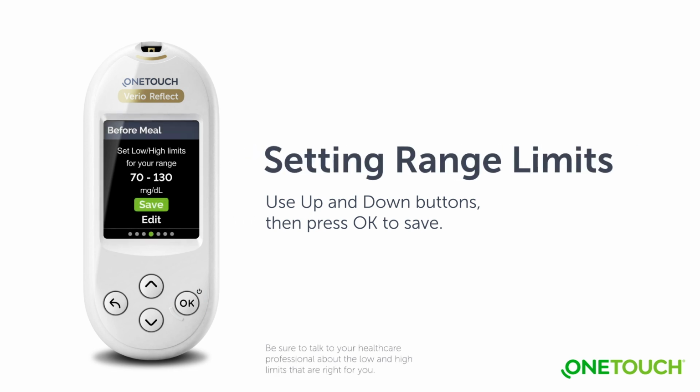Your meter uses the before meal and after meal range limits to tell when a test result is within, below, or above your mealtime range limits. The mealtime range limits you set during first-time setup will apply to all glucose results.